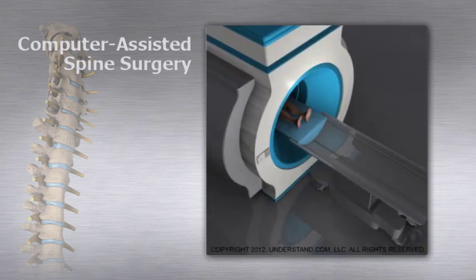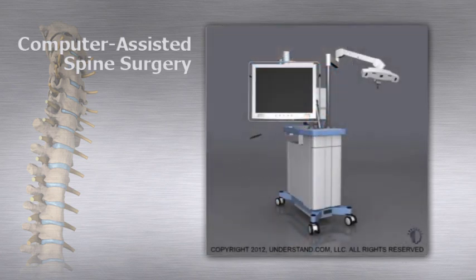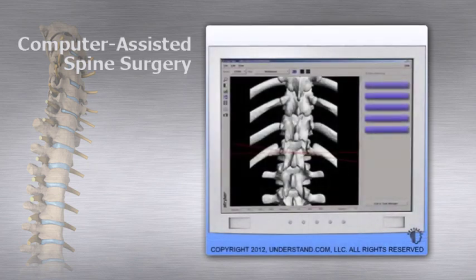Prior to spine surgery, imagery from a CT scan or MRI scan may be loaded into the computer. The software interprets the imaging data and prepares three-dimensional virtual images of the patient's spine. The surgeon can then study the images to pre-plan details, such as the proper size of instruments and hardware, or the best trajectories for inserting hardware into bone.